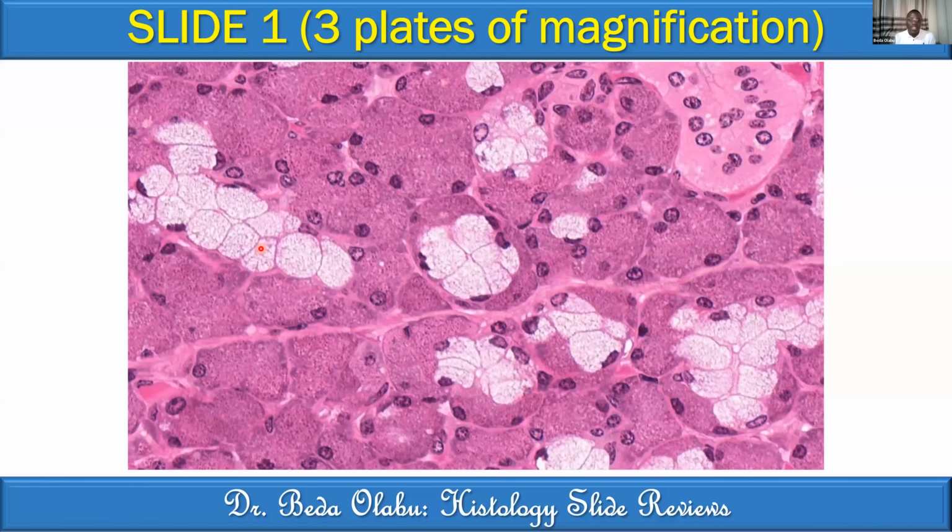This is a third level of magnification where we see a unique type of organization, the mucus acinus surrounded by some serous cells, which look like the crescent moon. We call that arrangement demilune. And because they are formed by serous cells, we call that serous demilune. We see serous demilunes in the submandibular salivary gland. And so that slide is the slide of a submandibular salivary gland.